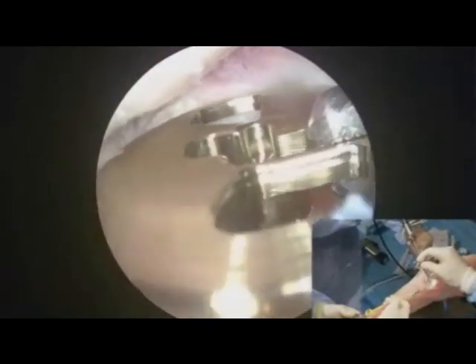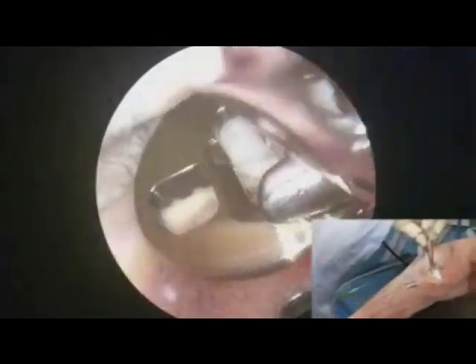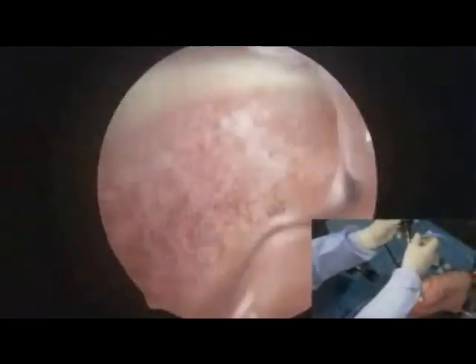Okay, so what we want to do is grab the blade right in line with the slot. Then on the outside, you can see I'm pinching the device. I'm disassembling the locking mechanism. And what I do is I unhook it in the joint, take the shaft out, pull the blade out of the joint. So now we've disassembled our mechanism, and we've cut our slot for our tibial implant. You can see there's our slot for our final tibial implant to go into position.